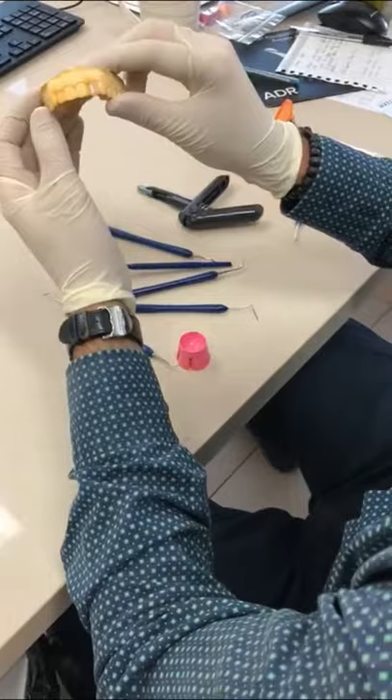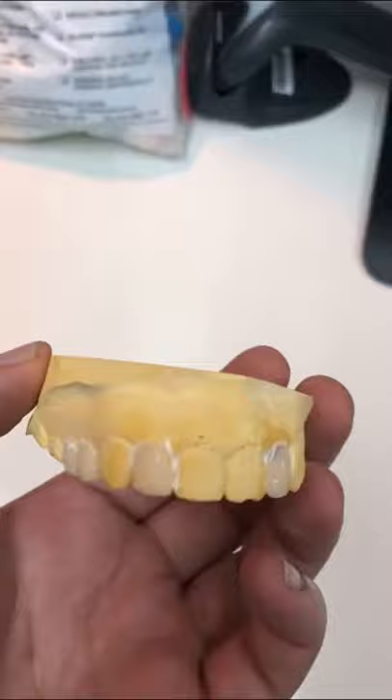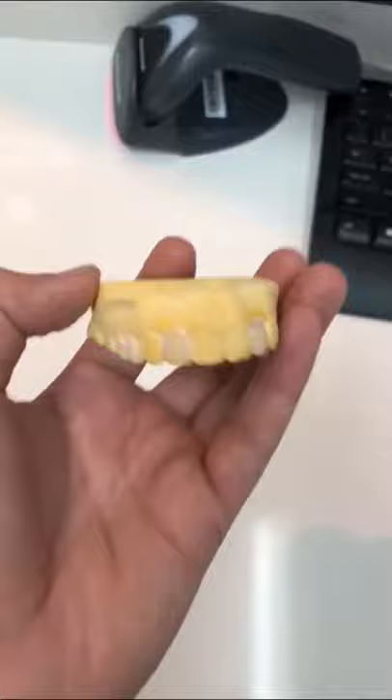We'll just do the rest of the teeth and we'll have our own handmade smile. So here we have our first rough design with veneers on the side, and we've built out the arch.